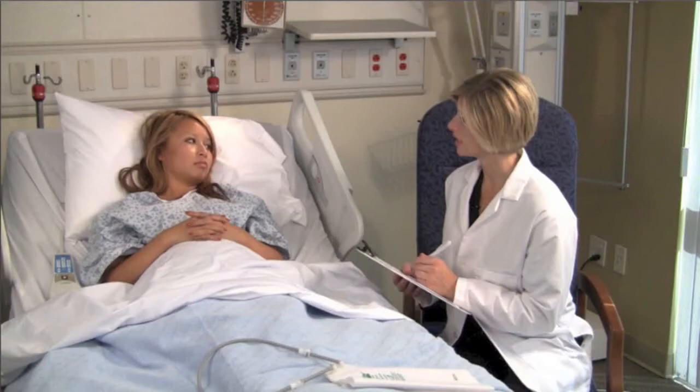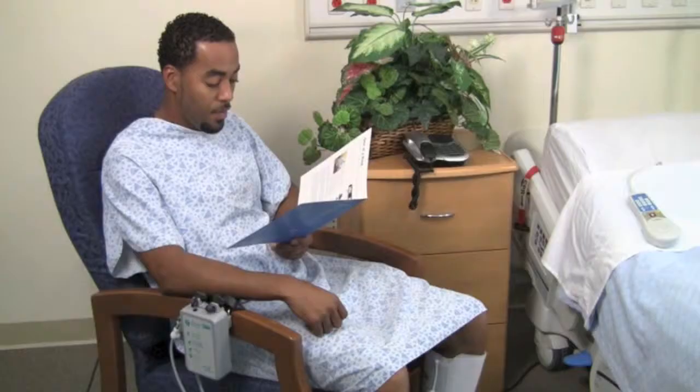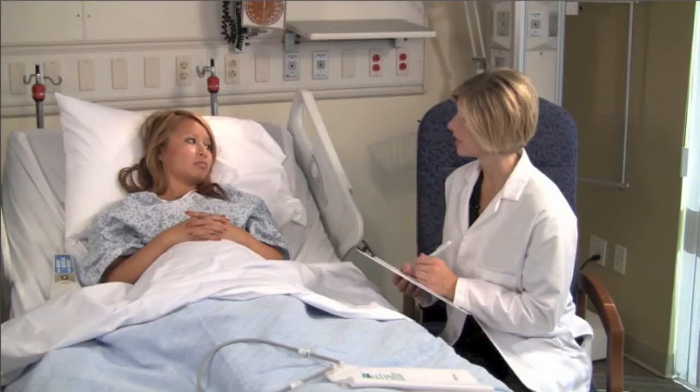Patients at risk for DVT are those who are sitting or lying for prolonged periods of time, diabetic, obese, pregnant, and those who smoke. Sitting for 4 hours or more reduces circulation in legs by 50%. Because of these risks, most areas of the hospital utilize these devices for preventative therapy.